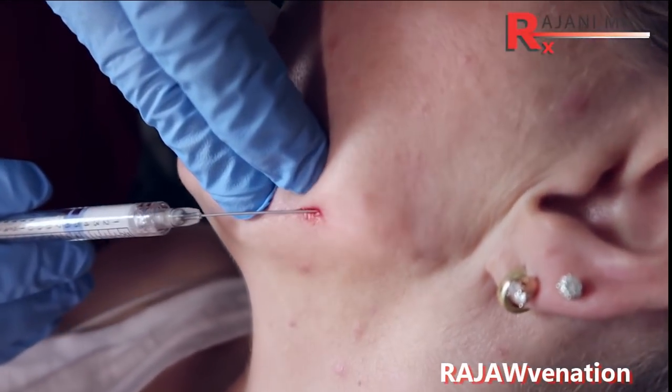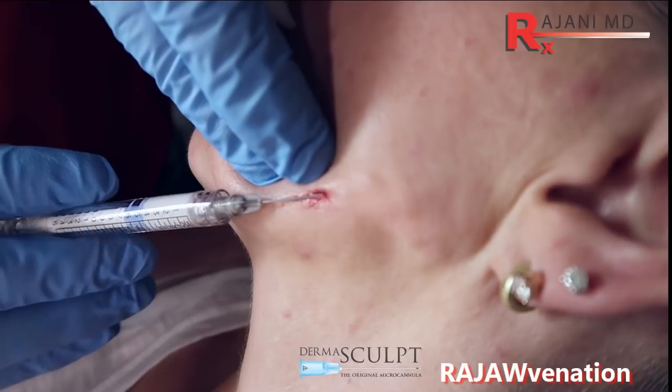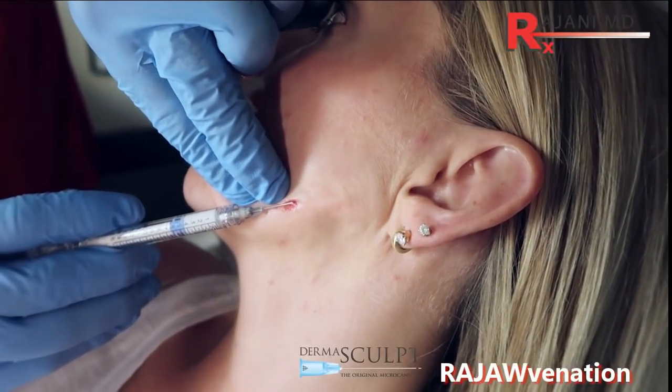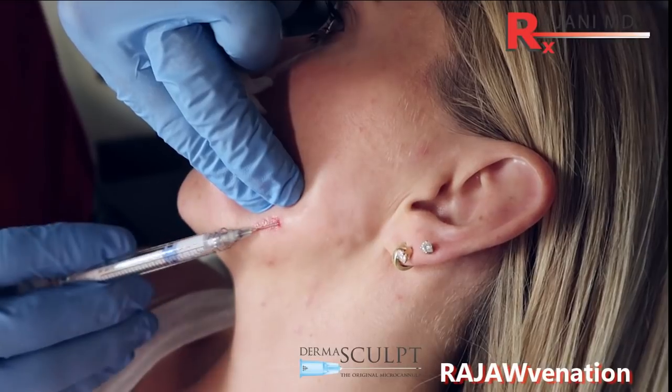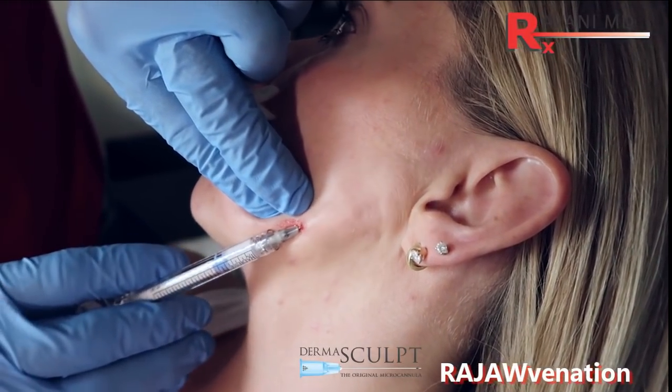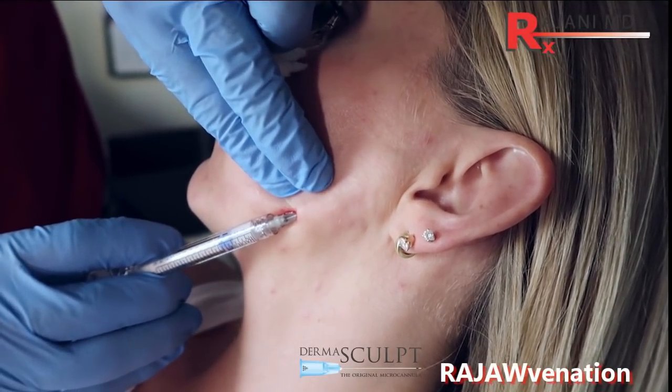It should be fairly painless, and you can see volume here. We're going to fill the area just in front of the ear — let's come through that same opening. Advancing through product, and because it's two inches in length it gives us some reach. You can see the cannula is flexible. A lot of people like different cannulas based on flexibility and ease of product flow. The 22 gauge flows easily, so you have to be careful not to put too much product in. Here I'm in the preauricular area on top of the parotid, just creating some volume.